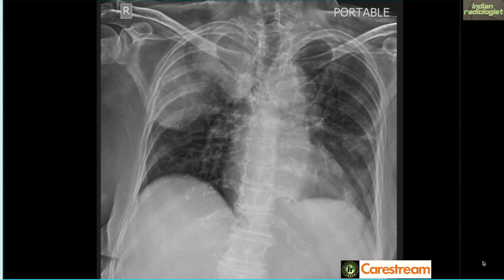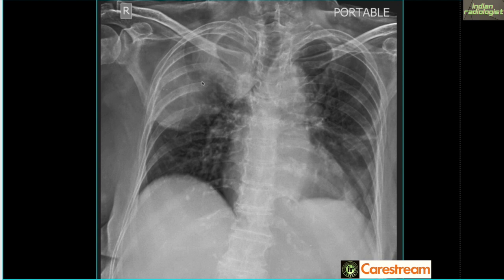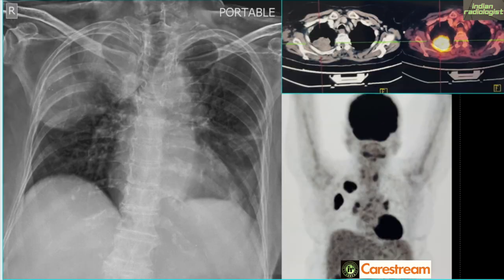A 55-year-old patient presenting with cough. What we can see is a bilobed mass lesion — it is called a mass lesion because it is more than three centimeters, there is no air bronchogram, it is not wedge-shaped, it is lobulated with a convex border, reaching up to the apex and pleural margins, and pushing the trachea slightly to the opposite side. CT scan was performed and subsequent PET-CT showed this to be a metastatic lesion from carcinoma of the colon.